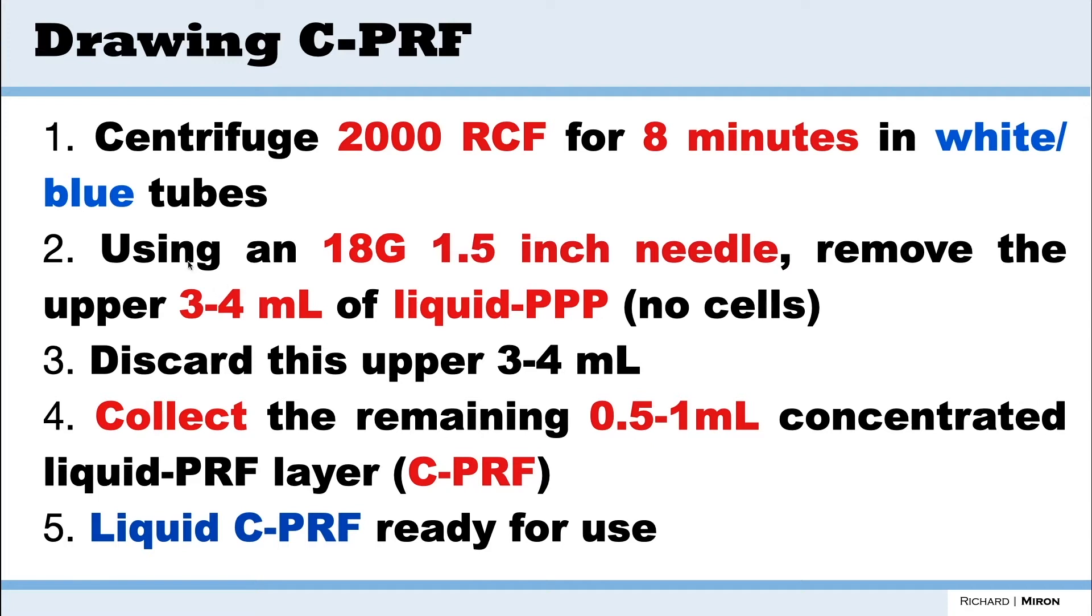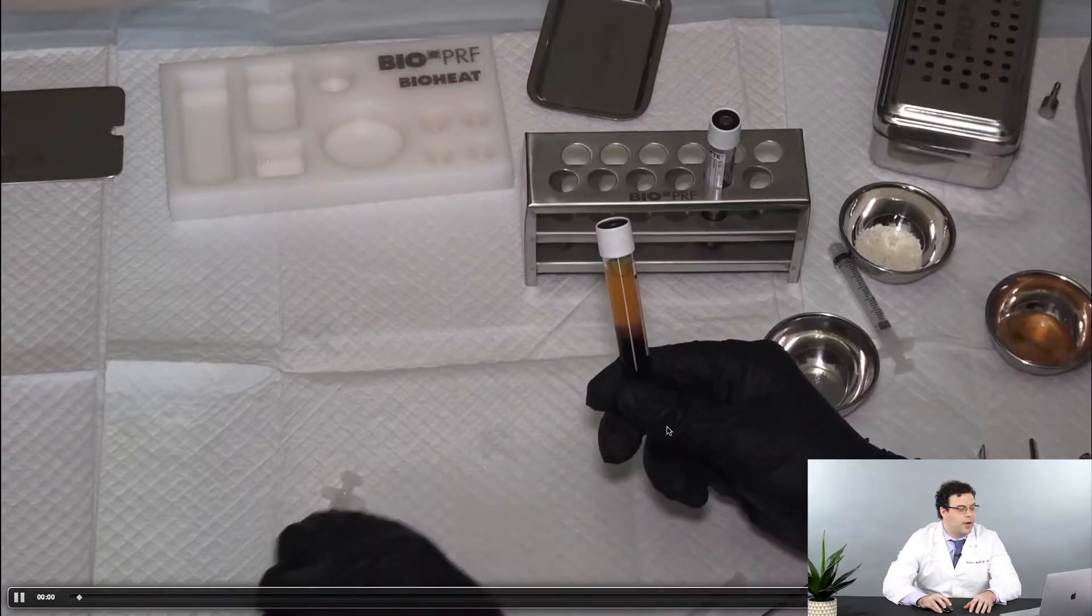What we're going to do instead is we're going to take that 18 gauge needle, remove the upper three to four mLs of liquid PPP. We're going to discard this upper layer and then we're going to collect the remaining 0.5 to 1 mL layer, and from there it's then going to be ready.